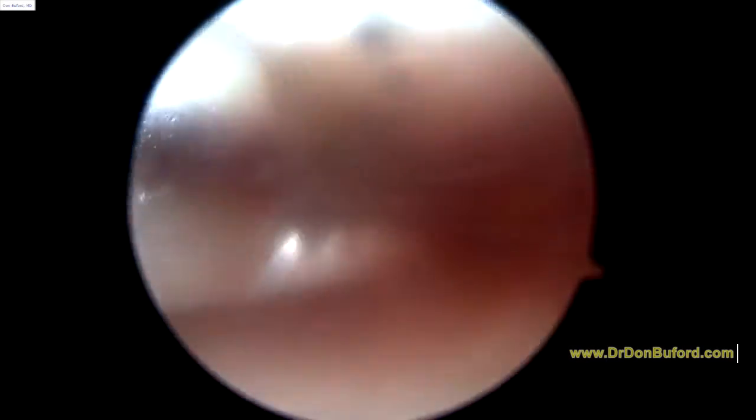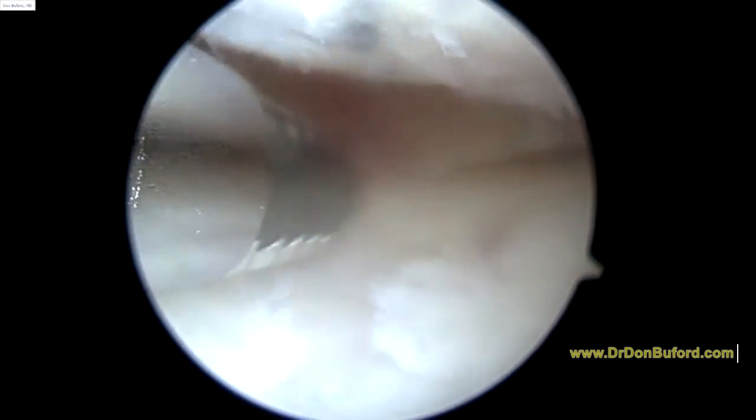We're just going to start on the left knee. We're looking at the inside part of the knee, what we call the medial compartment. Here's some of the arthritic changes at the top of the screen. This is on the femoral condyle — something we talked about in the office.